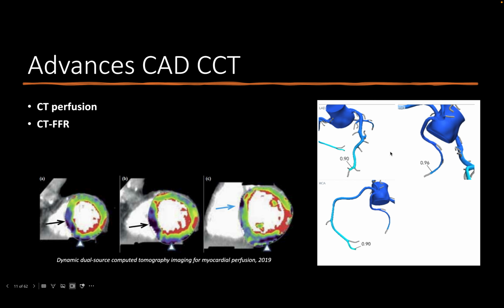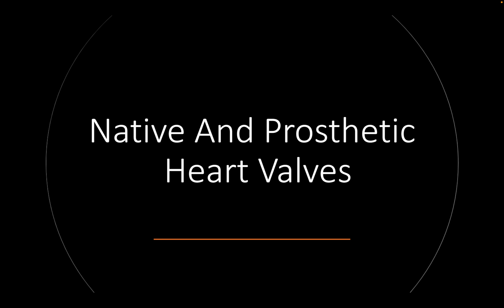Not only that, sometimes when we detect a plaque, a lesion or a moderate stenosis, it is difficult to understand whether it is functionally significant or non-significant. So after giving the GTN, CT-FFR could test whether this stenosis is causing the symptoms and is significant or not, in order to guide the later management of the patient.